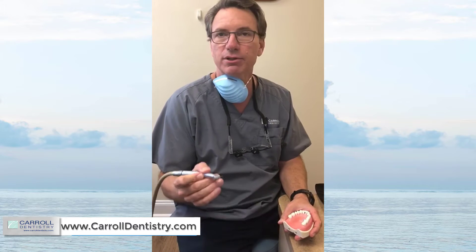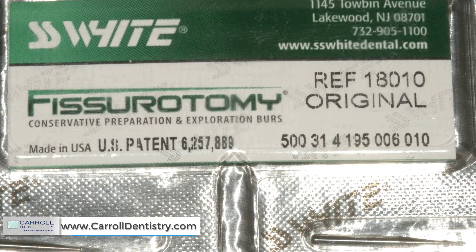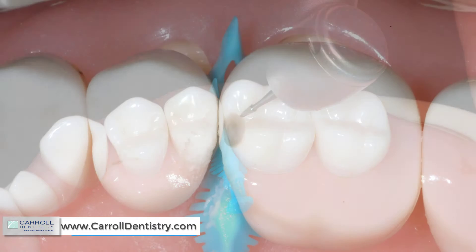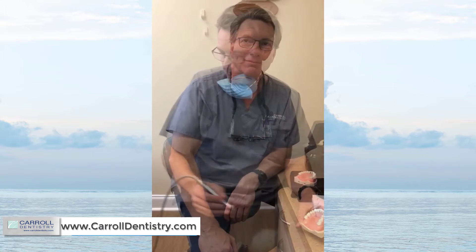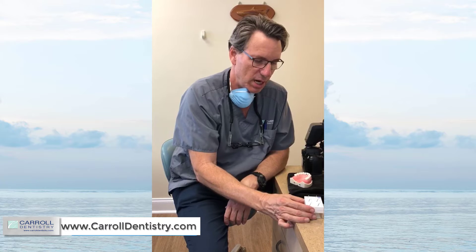The first bur I'm going to use is a fissurotomy bur — my favorite is the one from SS White; I'll include a picture of that. It gives you a minimal prep. We're going to keep a layer of enamel between us and the adjacent tooth and go down looking for the class two caries, whether it's to the buccal, the palatal, or right underneath the contact — generally it's right under the contact. After that very small minimal prep, mostly fissurotomy bur, I did a little bit of flaring with the Komet bur.